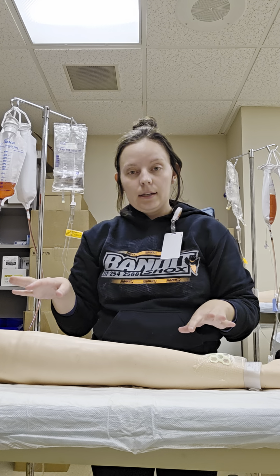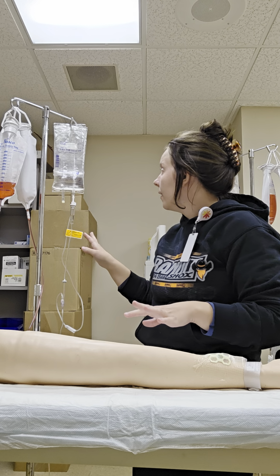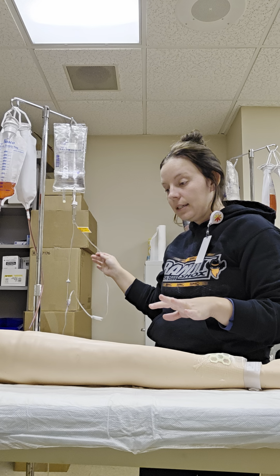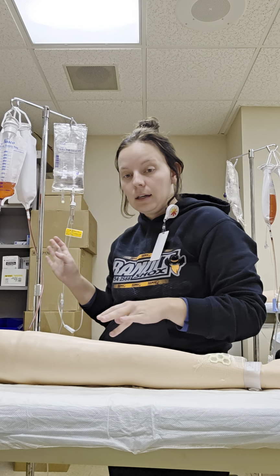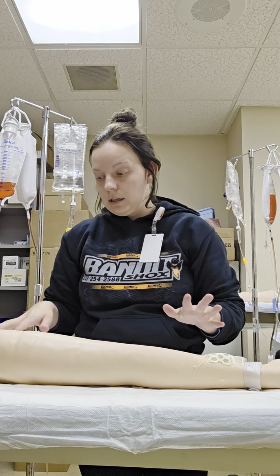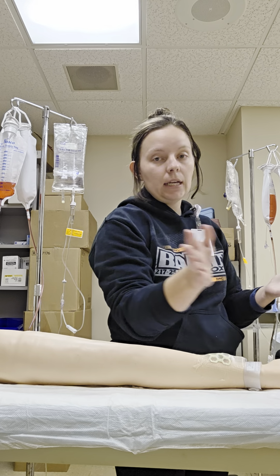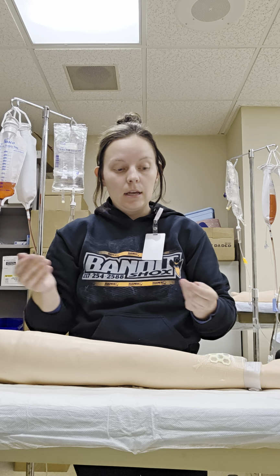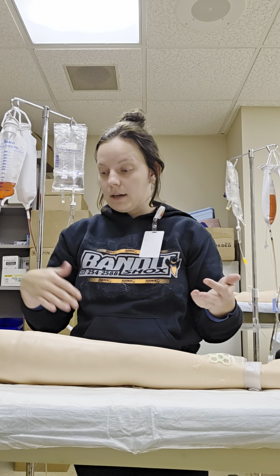So go ahead and make sure that that's hanging. I'm not disconnecting this IV or his piggyback. Going ahead and performing hand hygiene one last time, making sure that he has no other needs. He's comfortable. Bed is in a low lock position. Both side rails are up, and call light within reach.